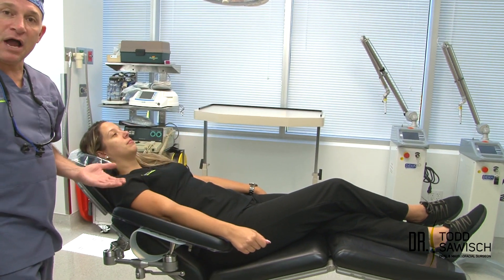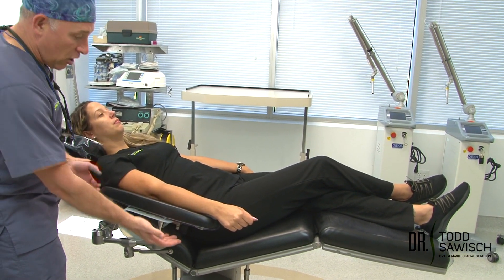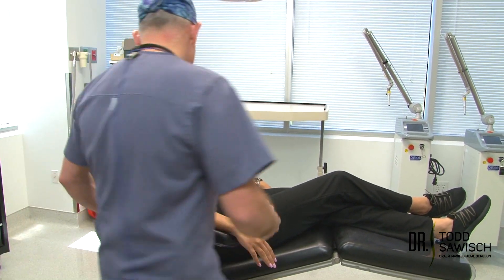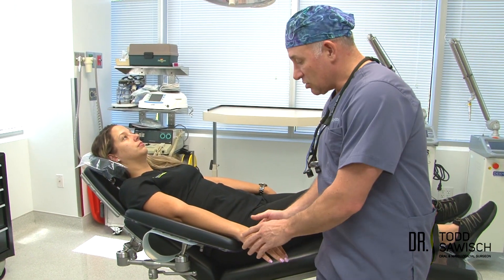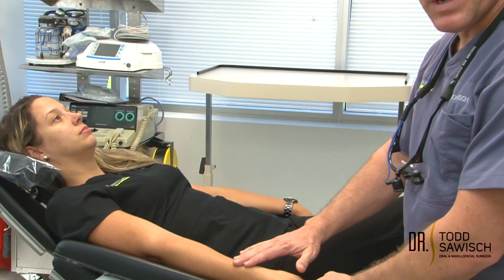First, the most important thing is making certain the patient is in the appropriate position. As you can see here, the patient is reclined. If you're going to start an IV, we do not want the patient sitting upward. The arm needs to be supported, and it's best that the arm is at the level of where you're going to start your IV. We're going to use the wrist here.